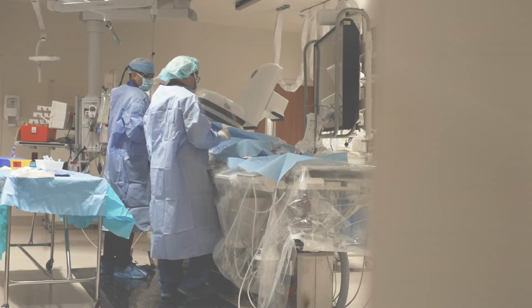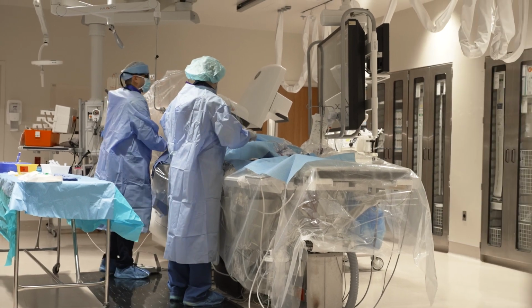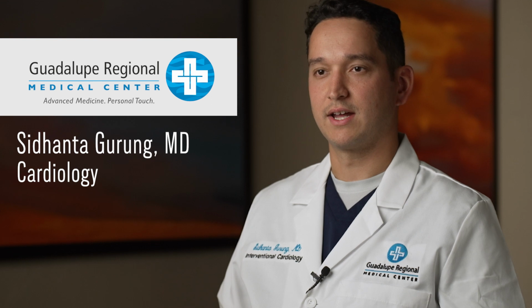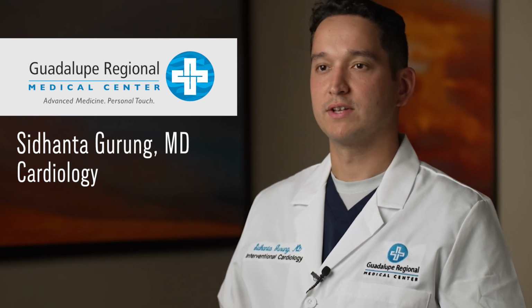So the catheterization lab is a procedure room in the hospital where we perform cardiovascular procedures. We use X-ray fluoroscopy to get high-definition images of the blood vessels of the heart and of the peripheral vasculature to help us diagnose coronary artery disease and perform interventions if needed.